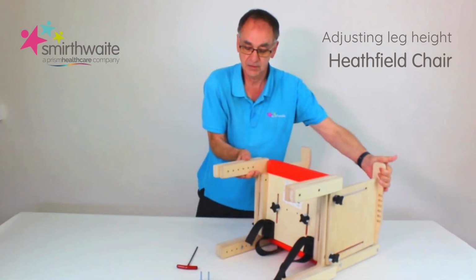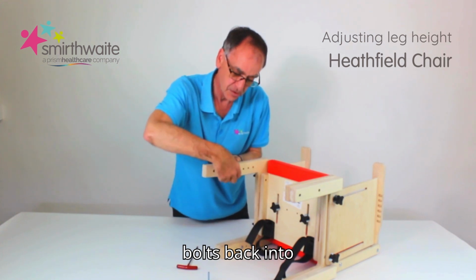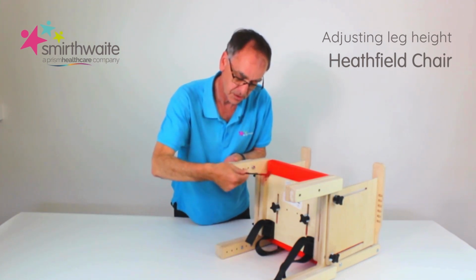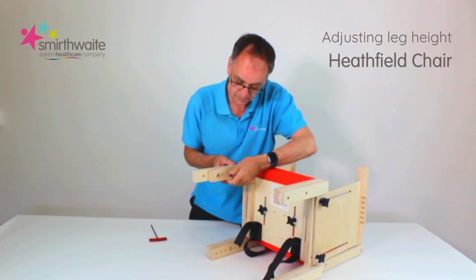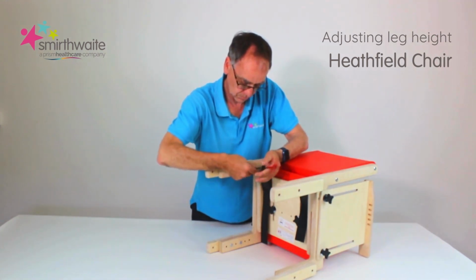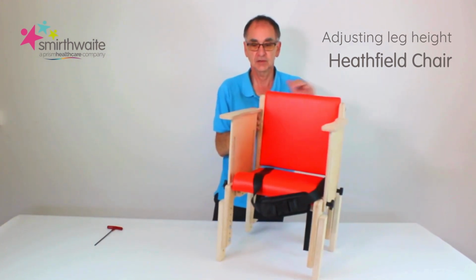And then, for example, if I want to make it a few centimetres higher, I just move it down and then position the bolts back into the holes which are on the outrigger. And then it's a simple question of retightening the bolts using your 4mm Allen key. And there you have our Heathfield with the legs which have been raised by approximately 2 centimetres.